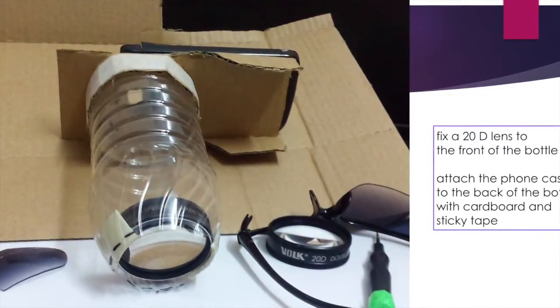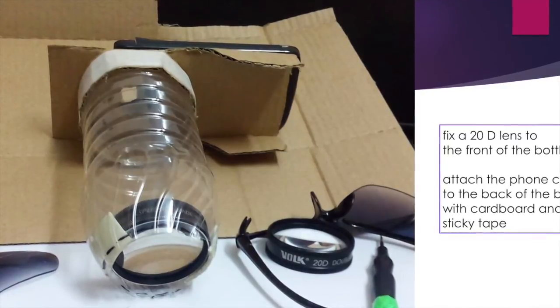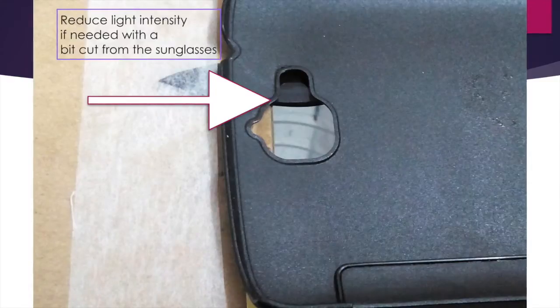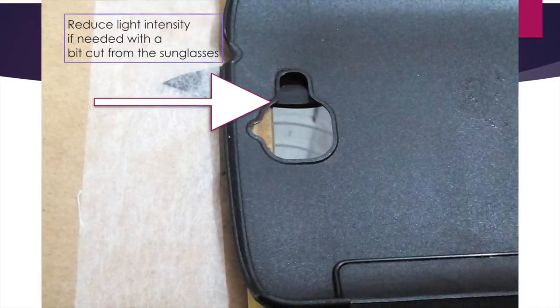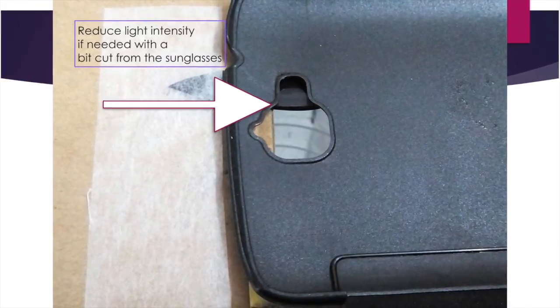In the back of the same bottle you can fix the cardboard piece and attach the smartphone case to the opposite side of the cardboard piece. You can reduce the intensity of the light if you need to do that with a bit cut from a pair of sunglasses.